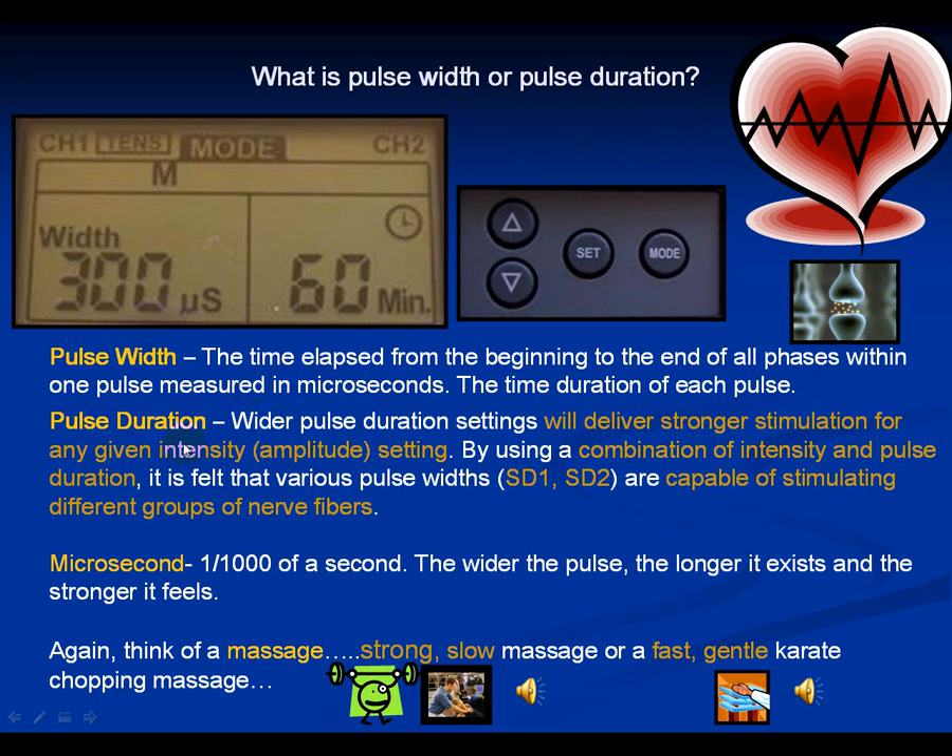Usually, the wider the pulse duration, the stronger the stimulation for any given intensity. By using a combination of intensity — the amplitude dials on top — and pulse duration, you are capable of stimulating different groups of nerve fibers.